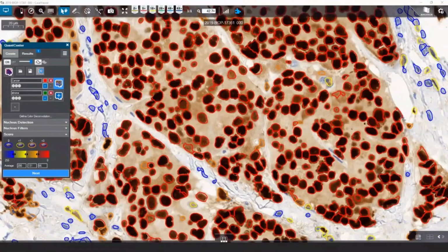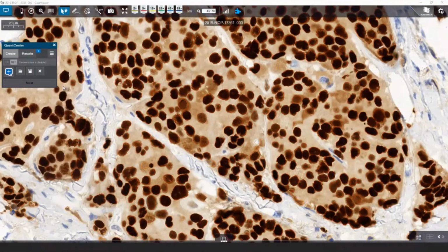Before closing it, I just would like to show you quickly the modules. Basically, we have general purpose tools for tissue segmentation, such as PatternQuant and HistoQuant. We have IVD certified purpose-built tools such as NuclearQuant and MembraneQuant for nuclear and membrane detection.